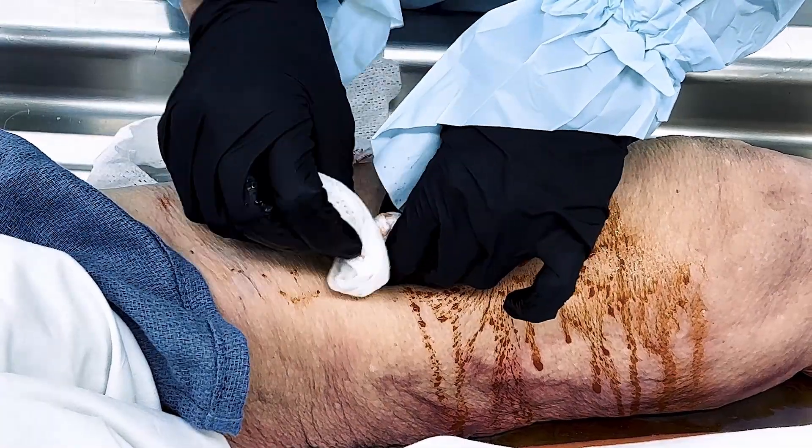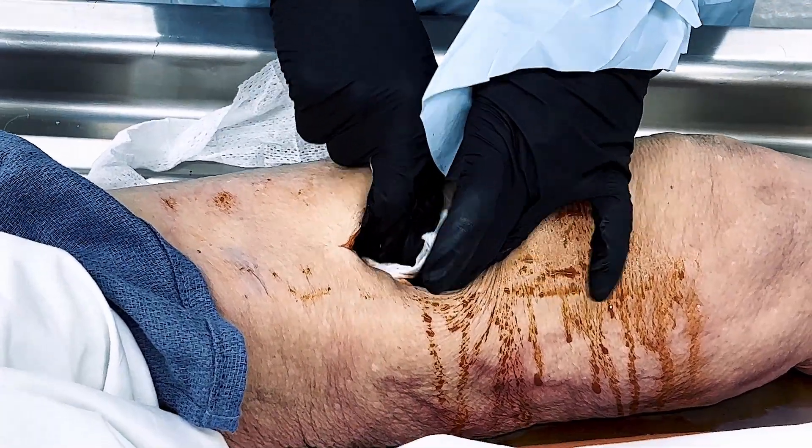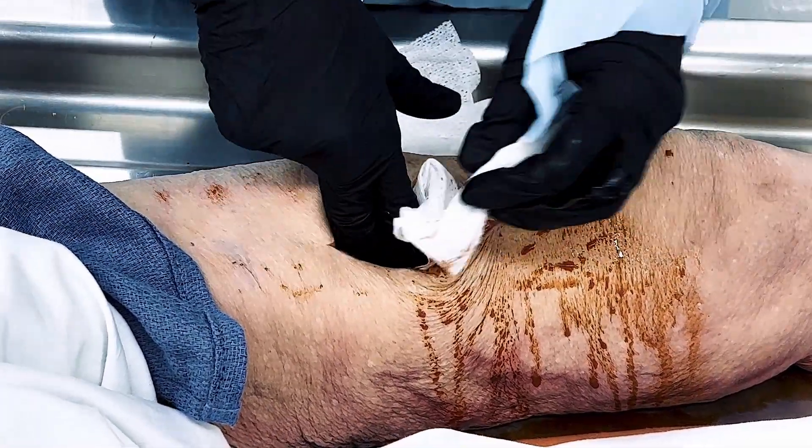With either method, maintaining constant pinpoint pressure on the bleeding site is fundamental to the success of this procedure.